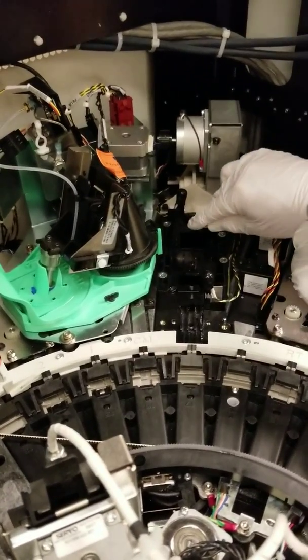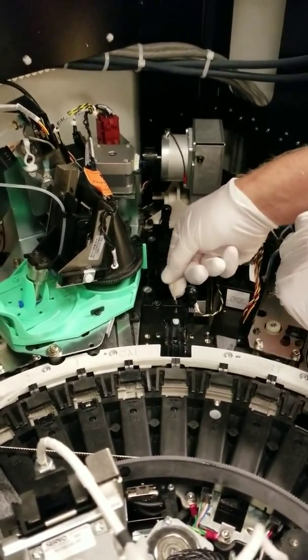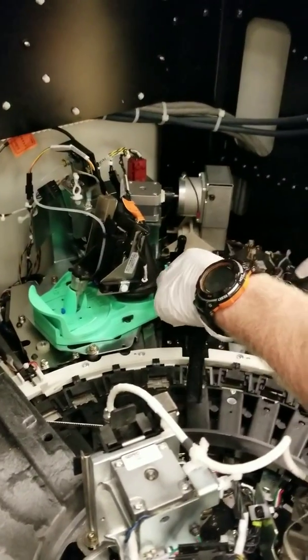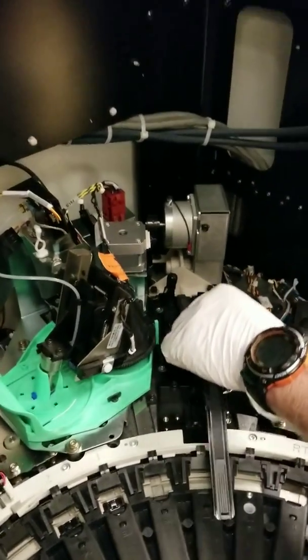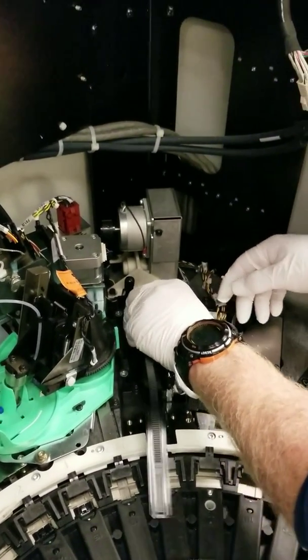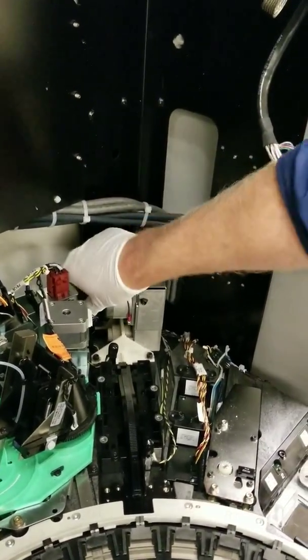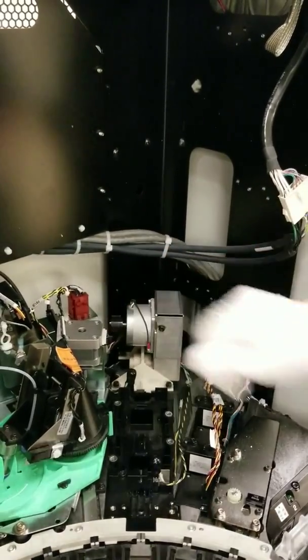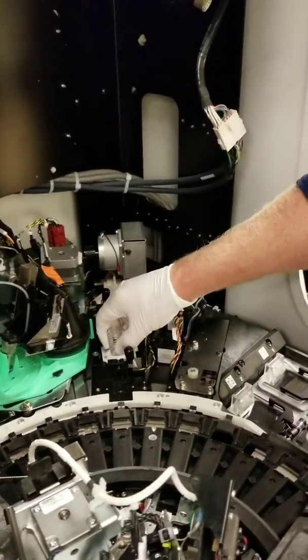Next, clean the sensors under the tip locator. Now we replace the dispense blade — put it back into its slot and turn the knob clockwise until it clicks. Next, replace the dispense tip cover and the tip locator.